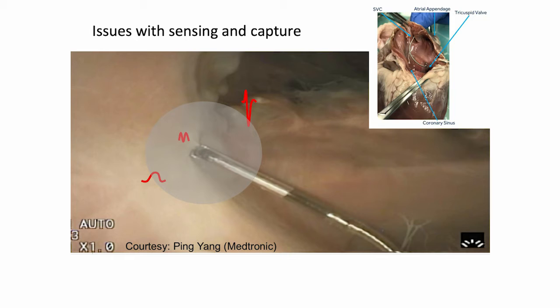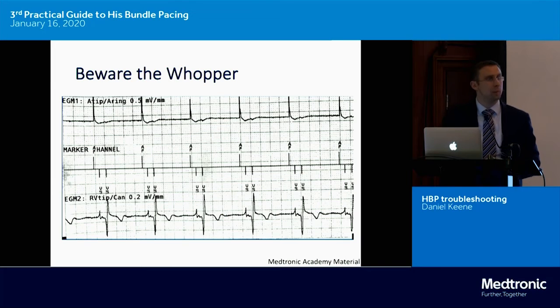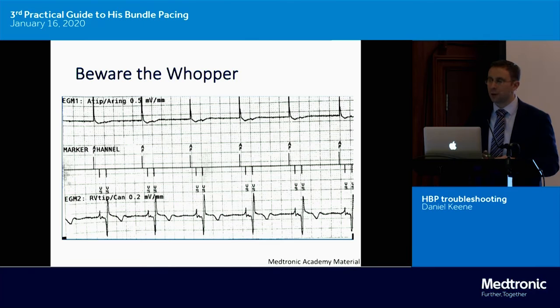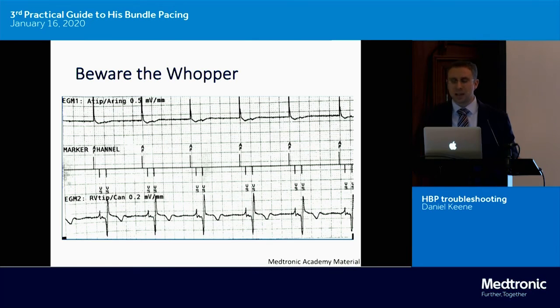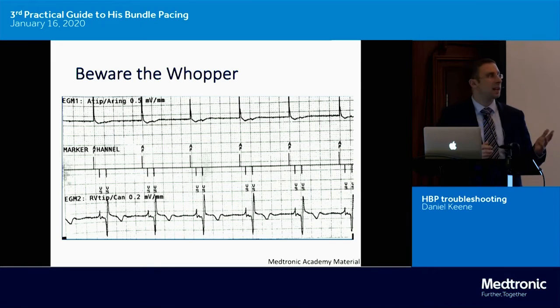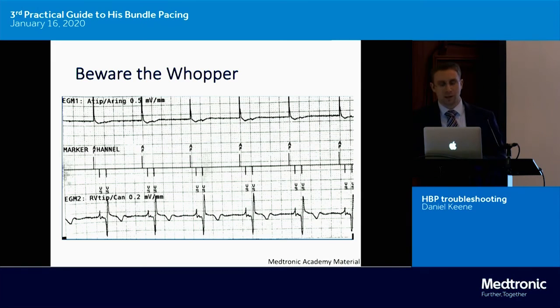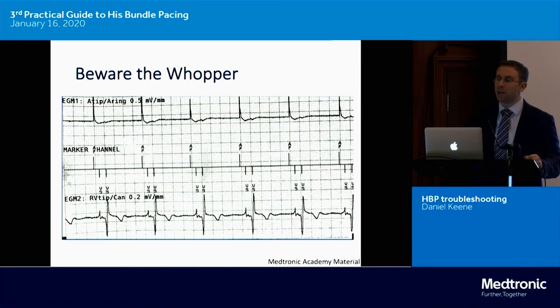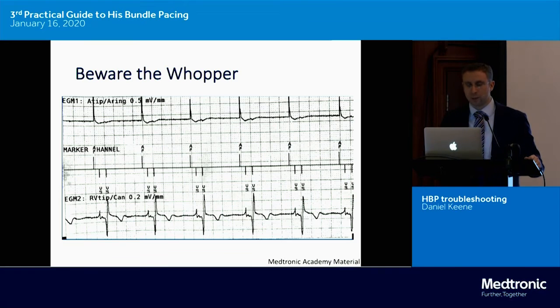So now let's move away from the atrial oversensing and think about His oversensing itself. You might think during mapping, the bigger the better when it comes to a His signal. This is not always true. Similar to atrial oversensing, a massive His signal can affect sensing and cause potential mischief. But actually, we manage it in the same way as atrial oversensing, by adjusting sensitivity or even sensing polarity. And more often than not, that will result in a better ratio between electrograms.